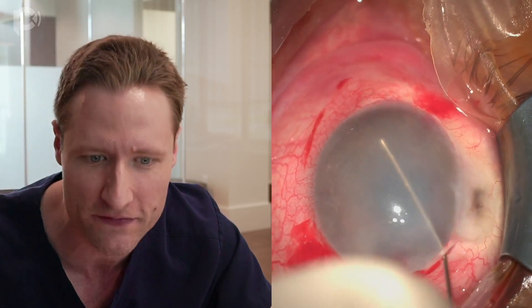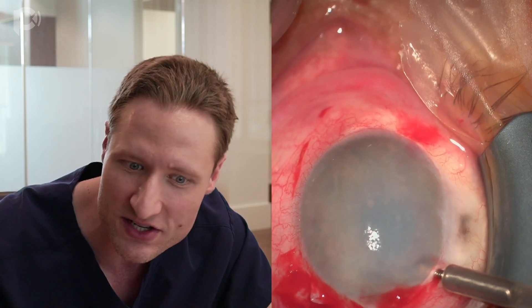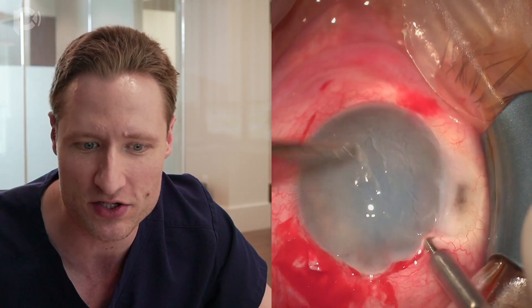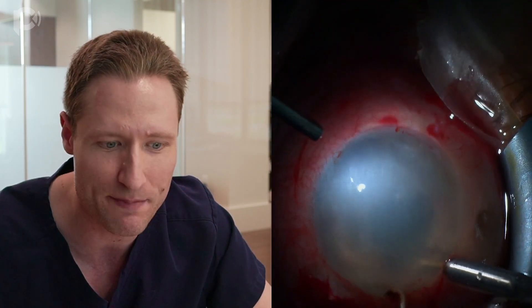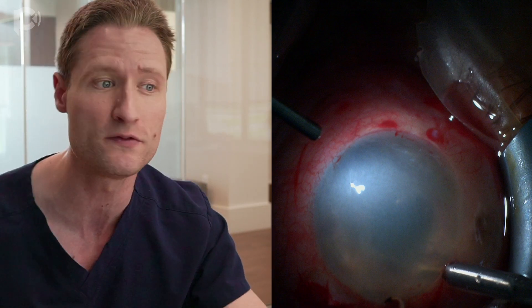Now I'm removing the air fill from the anterior chamber and verifying we have a deep chamber all the way around. I'm reinstilling the AC maintainer hooked up to balanced salt solution, and you'll notice I'm debriding the corneal epithelium. Why wait until now to take the epithelium off? Visibility is poor and you want great visibility during graft unfolding — that's the key moment. Once you take the epithelium off, visibility is transiently quite improved but then rapidly declines as the cornea swells. So remove the epithelium not at the beginning of the case, but right before you need to see as well as possible.